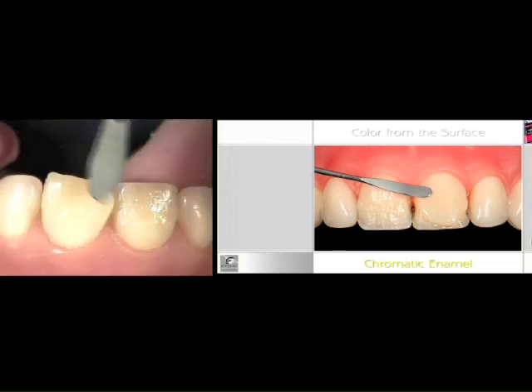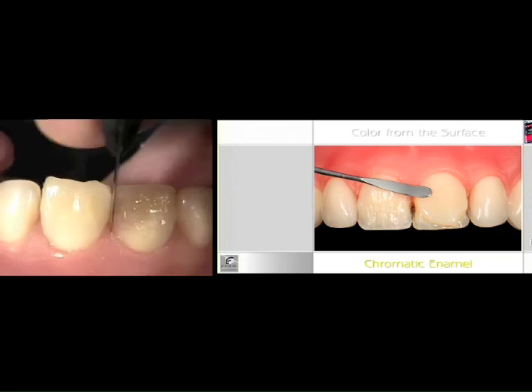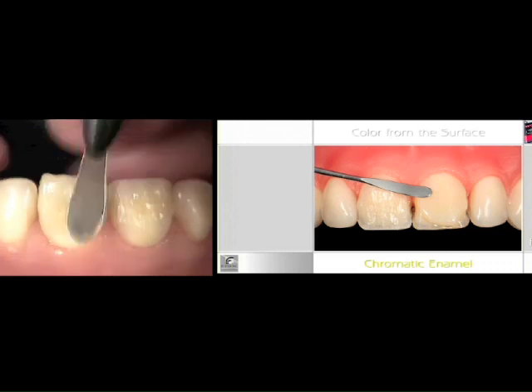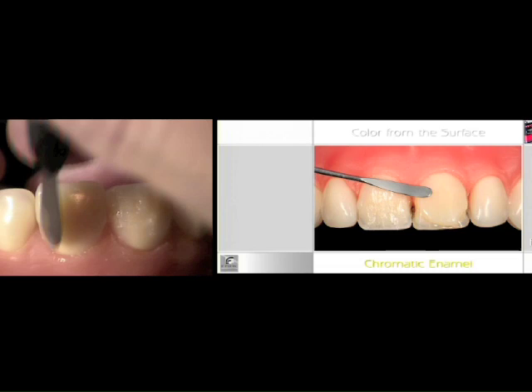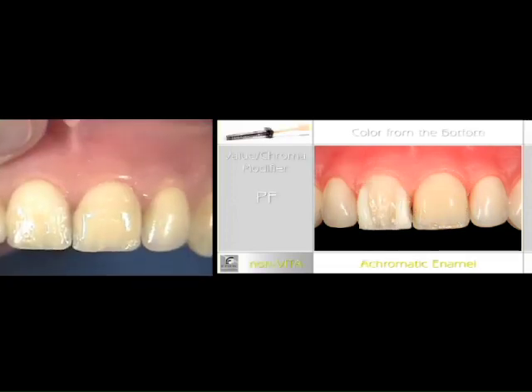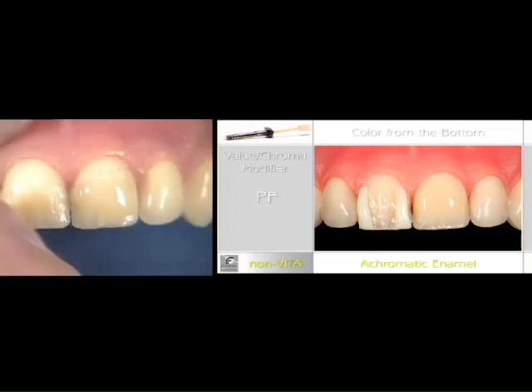What I'm doing here is pretending this is my very final shade and giving it the final contour. On the achromatic approach, using the achromatic enamels — I have an A3 Dentin underneath here from Vital Essence.